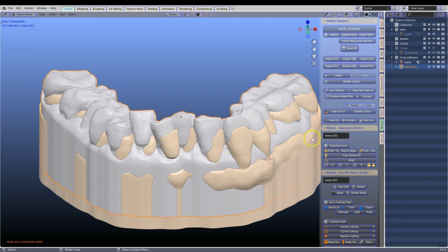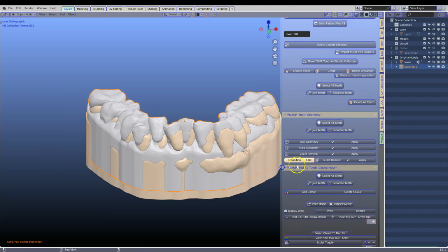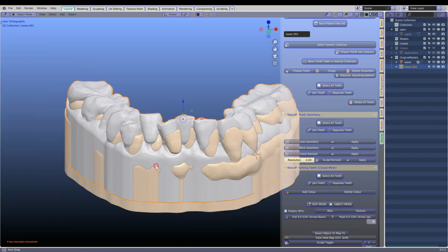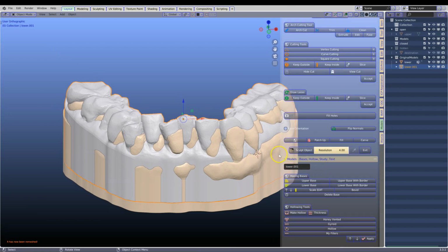Therefore, I'm going to go into the wax up module and we're going to remesh this one with the sculpt remesh tool, and I'm going to keep that at 4, and we're going to apply that. The reason why I'm using that is to maintain the surface topography of the teeth. This mesh is ideally suited for sculpting.